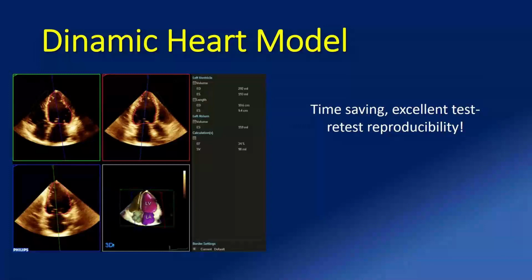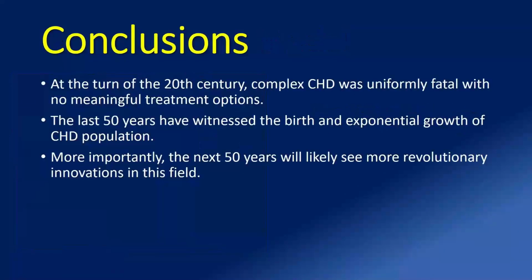All this will reduce a lot the time and improve the quality of our acquisition with an excellent test-retest reproducibility. And as I stated in the previous slides, I think for the follow-up of our patients the longitudinal assessment of the parameters is very important, rather than a single cutoff value. So reproducibility will improve a lot our diagnostic accuracy. And with this I come to my conclusion.